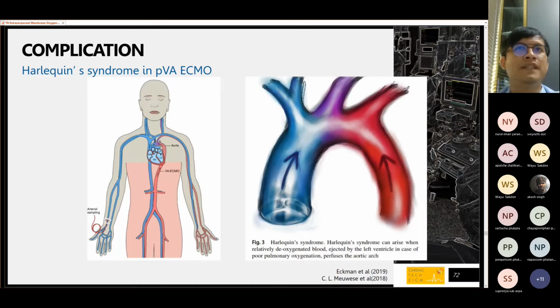For the first 4 or 5 days, the ECMO ran with good function, so it could support the whole body. But after that, we found different skin colors here, and we decided how to bring him back, but it took a few days.